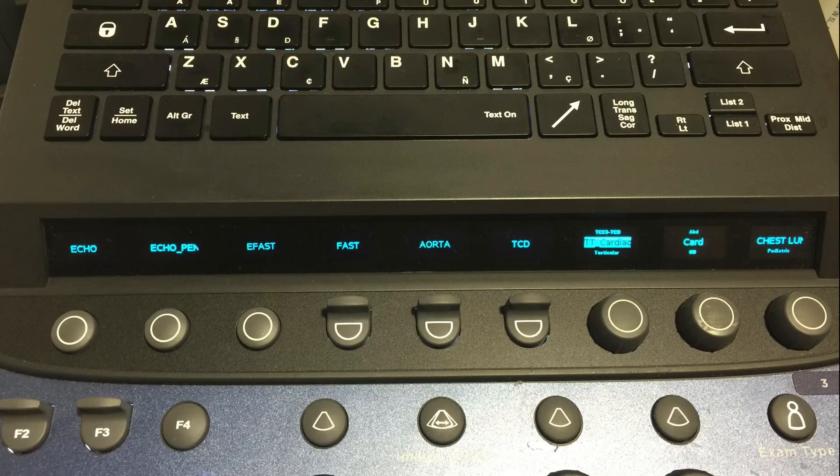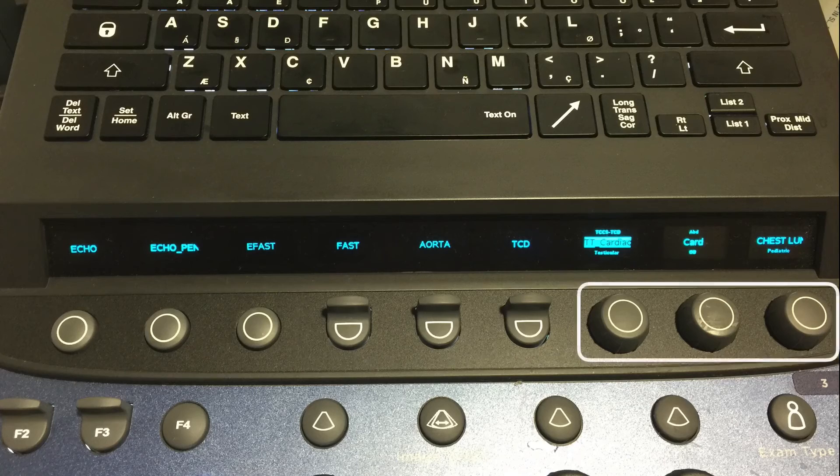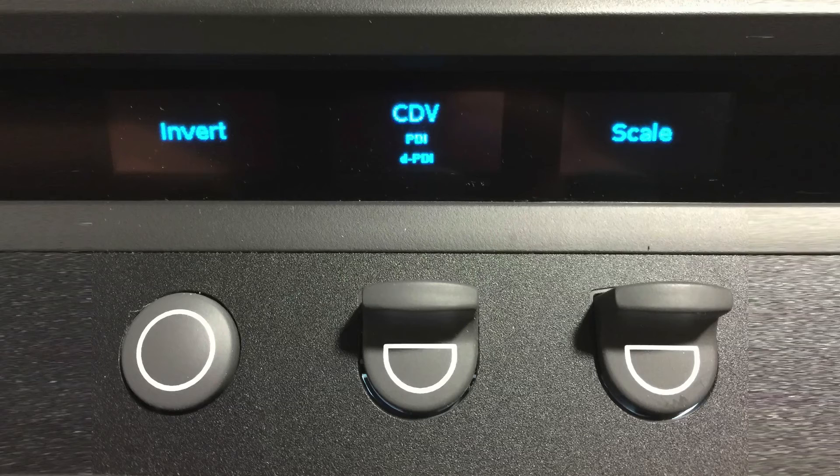The soft keys will again be used for each of the modes to change some settings. There will generally be buttons, toggle switches, or dials. You can invert the scale with the button, adjust your scale with the toggle switch, and switch between color Doppler velocity imaging and power Doppler imaging with the middle toggle switch.